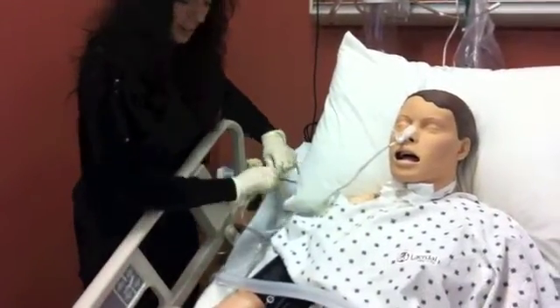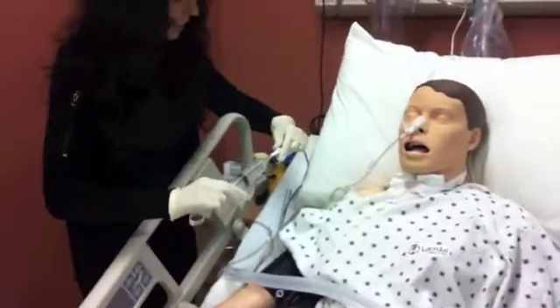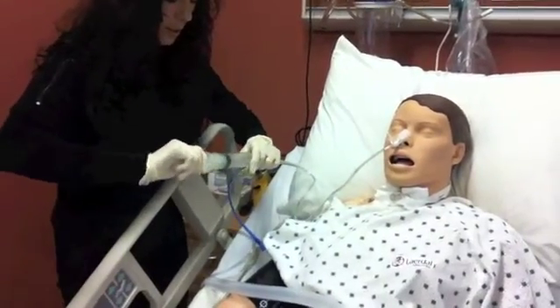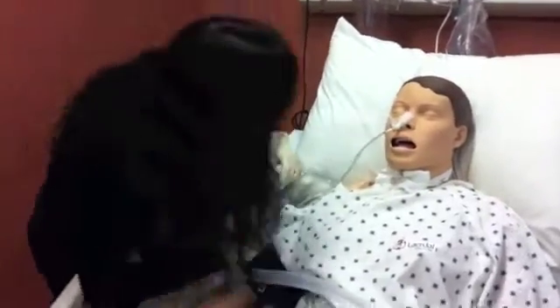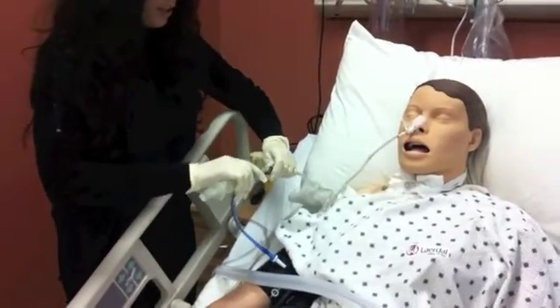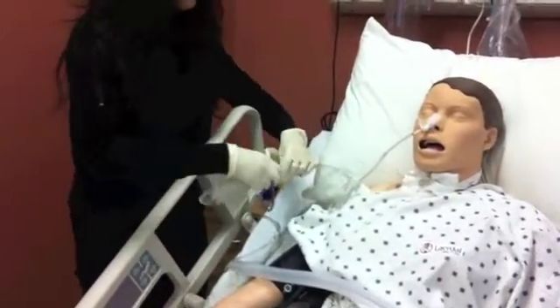Take your syringe with air, open the tube, and insert. Aspirate about 10 milliliters and confirm that you get some gastric return. Then insert the air while listening with your stethoscope to make sure air is going in correctly.